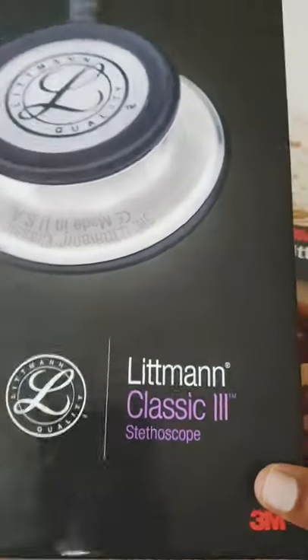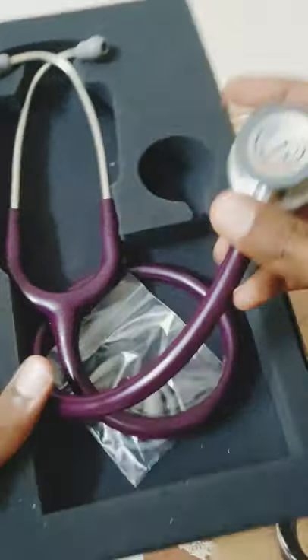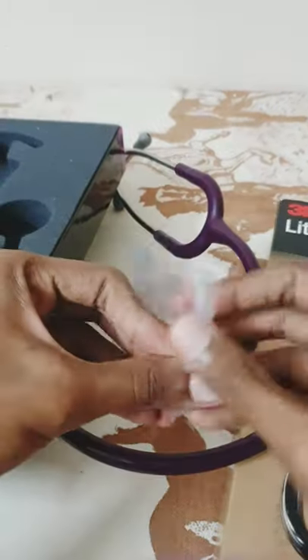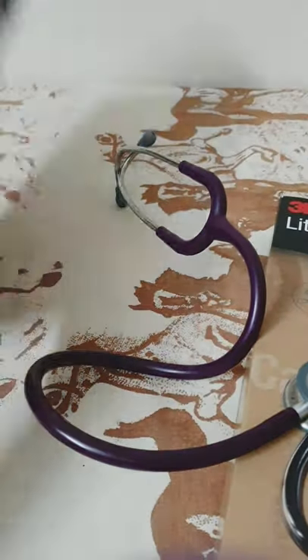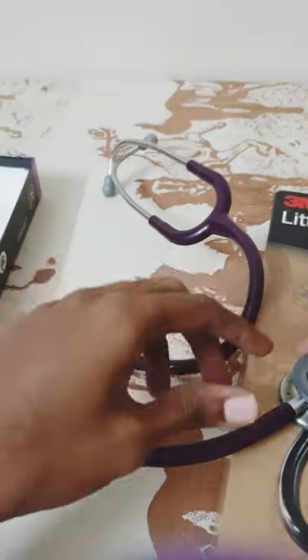Blitman Classic 3. So let's open the box. Here we have the item and here we have its manual just inside. This is the one which we need to convert into an open bell.